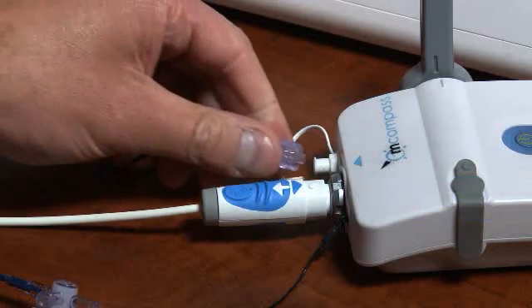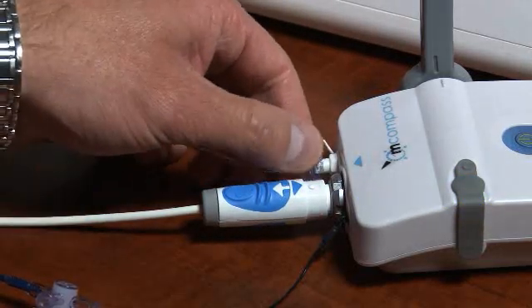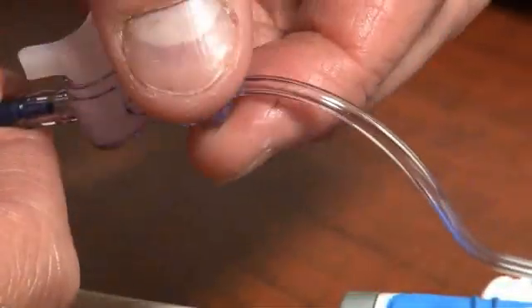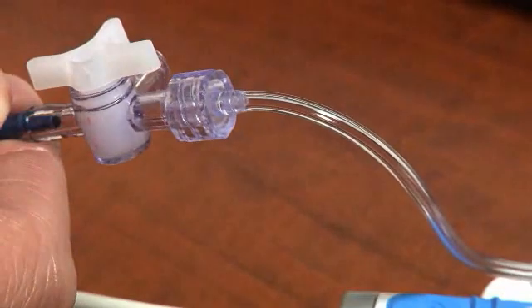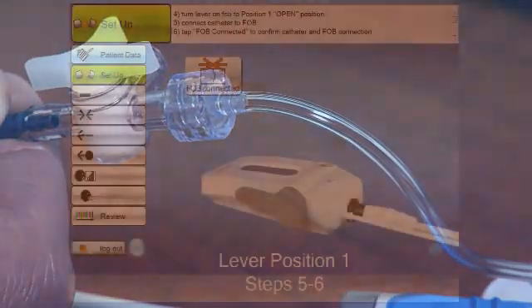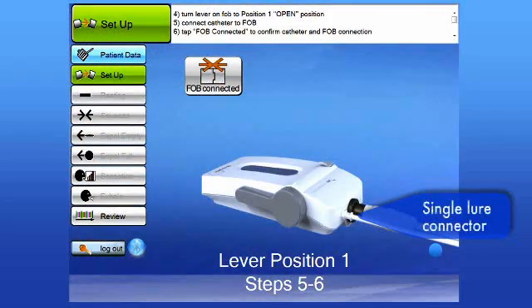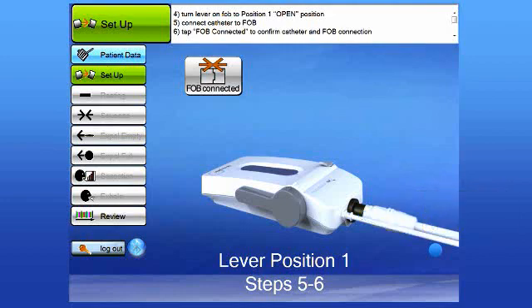The next connection is the three inch long extension tube. One end of the tube connects to the four-way stopcock that's part of the catheter. The other end is connected to the single lure connector, located on the front of the FOB next to the anal canal measurement balloon port. Once you have made both connections, tap the FOB connected button and verify that the connections are correct and properly sealed.